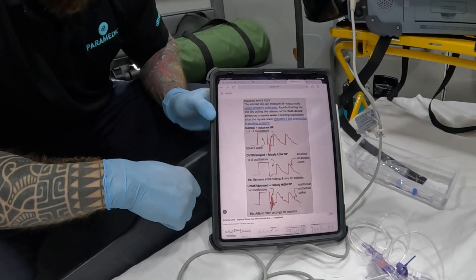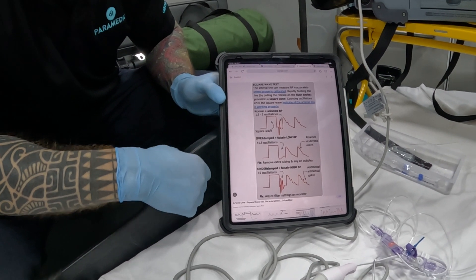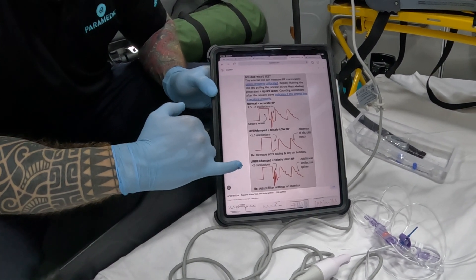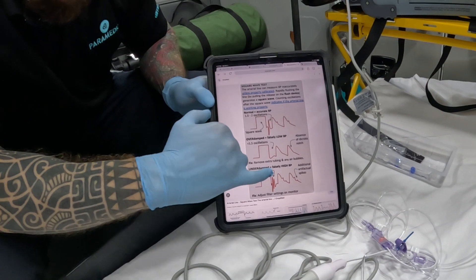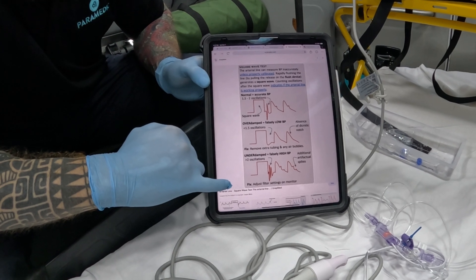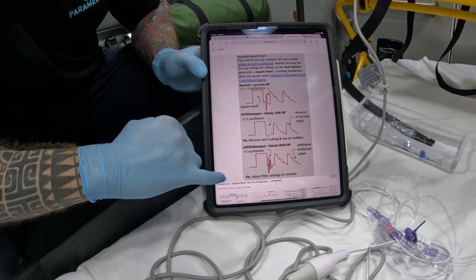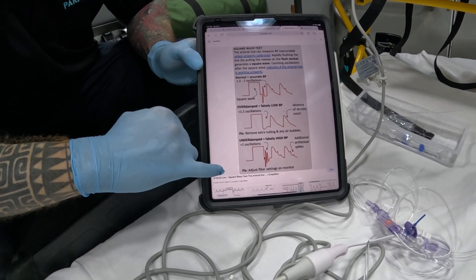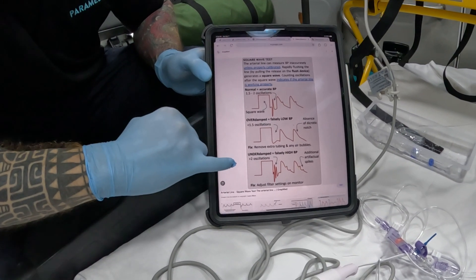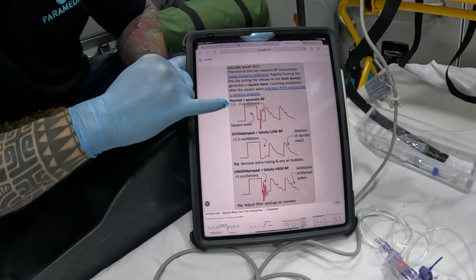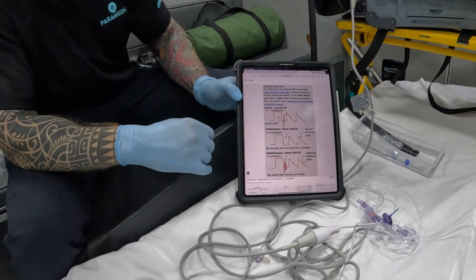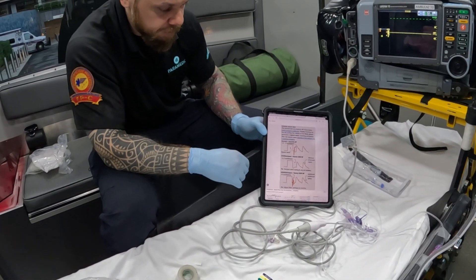Something else can also happen — this is called underdamped, where your blood pressure is falsely highly elevated. When you snap flush it, you'll see way more than 2 oscillations — greater than 2 — with additional artifact and spikes. This can be secondary to non-rigid tubing, not having flushed everything properly, or air bubbles. Both overdamped and underdamped are inappropriate. What you're looking for is normal: 1.5 to 2 oscillations.